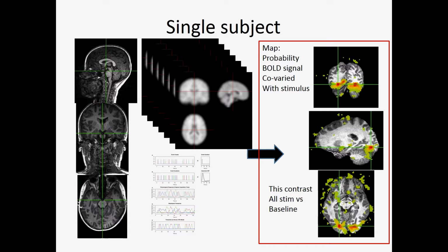When we do this, as a sanity check to make sure that we're coding things correctly and that we're grabbing something, we usually have some big thing where we look at how much of the total variance is explained. In a task like this, where we have a lot of visual stimuli, we expect to see some really strong activation in the visual system. So usually when we go through a single subject, we check just to look at it and say, okay, it looks like it's supposed to look, before we do a whole lot else.